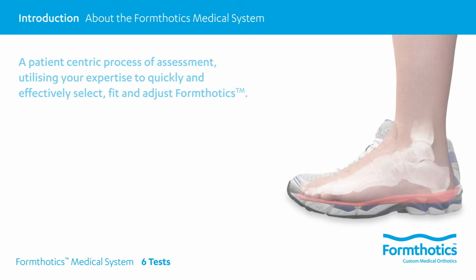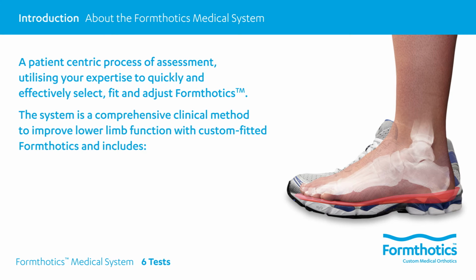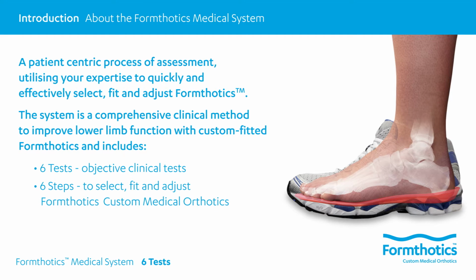The Formthotics medical system is a patient-centric process of assessment utilizing clinician expertise to quickly and effectively select, fit, and adjust Formthotics. It is a comprehensive clinical method to improve lower limb function with custom-fitted Formthotics. It includes the 6 tests, objective clinical tests, and the 6 steps to select, fit, and adjust Formthotics custom medical orthotics.